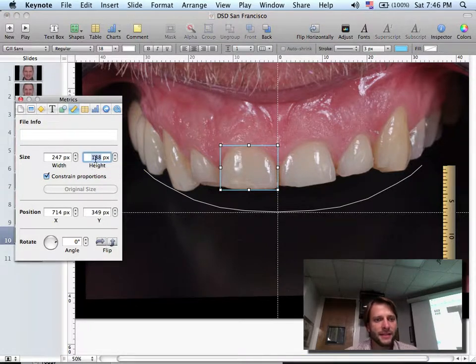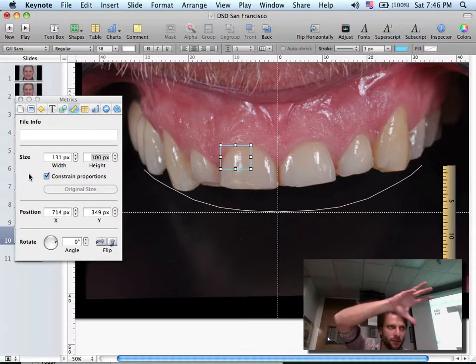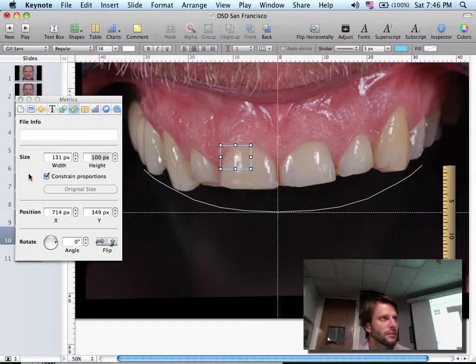So if I write 100 on the height, once I press enter, it will change the width. Now it gave me 131. What does that mean? It means that the proportion of the central is 131%. That means it's 30% wider than longer. So it's the opposite than the ideal central. Okay?